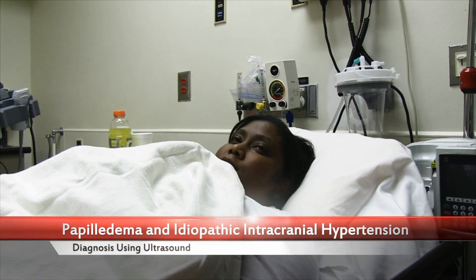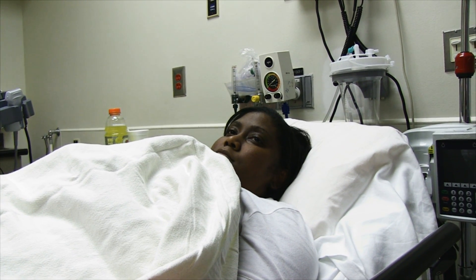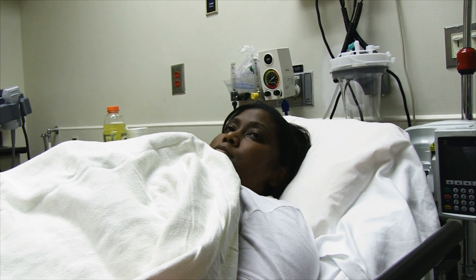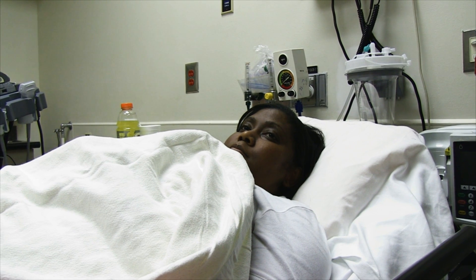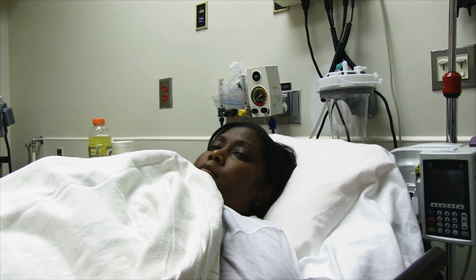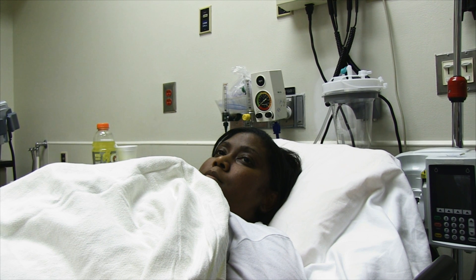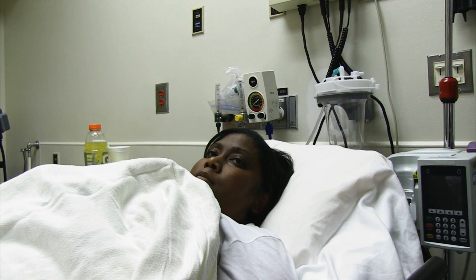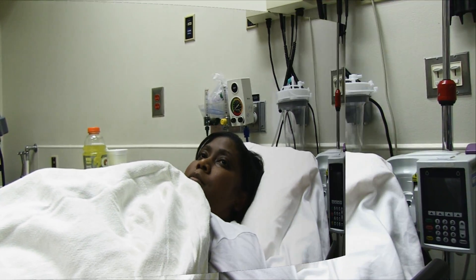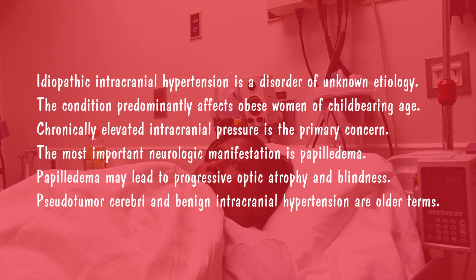I appreciate you letting me do this video — these videos end up on YouTube. What I want to demonstrate today is basically the ultrasound study demonstrating papilledema. You've had a headache going on for three weeks, it's worse in the mornings, and your vision started getting blurry. You went to see the ophthalmologist, who said you have bilateral papilledema — swelling of the nerve in the eye. They sent you down here, we did a CT scan, and the CT scan was normal. Our working diagnosis so far is idiopathic intracranial hypertension, or pseudotumor cerebri, which is the old name. The diagnosis is going to be dependent on doing a spinal tap and checking for increased pressure within the central nervous system.